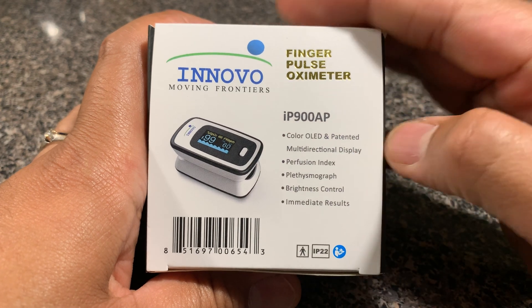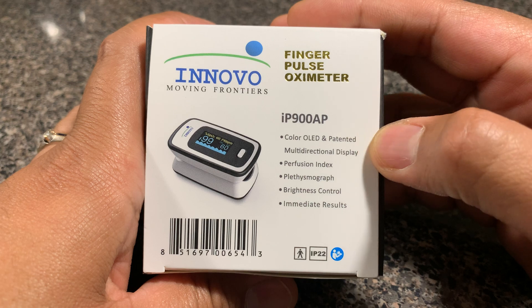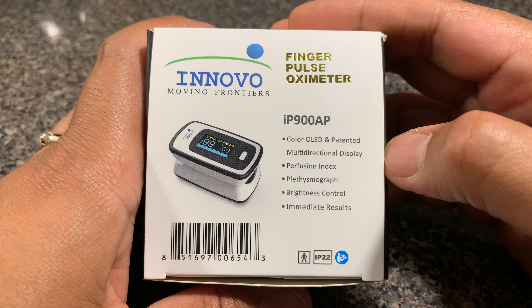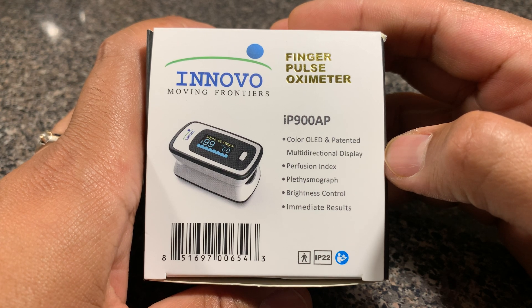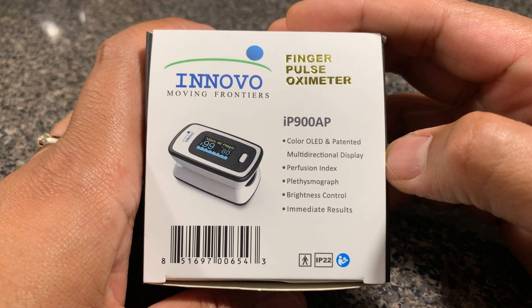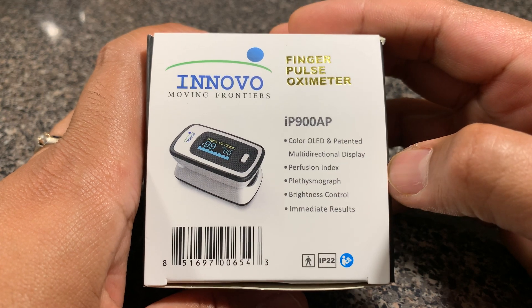Before I dive right into the product review, giving you a demo and sharing my thoughts, I also wanted to put out a disclaimer that I'm not a medical practitioner and the contents of this video should not be seen as expert medical advice. It is only a consumer review of this product and my thoughts as a consumer, so take it for what it's worth.